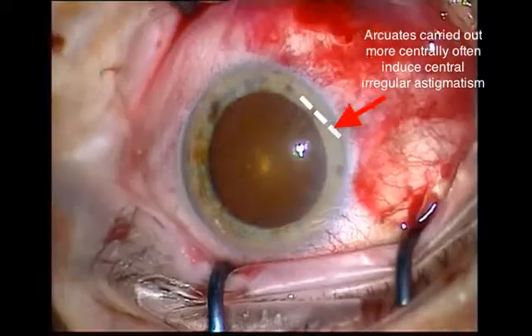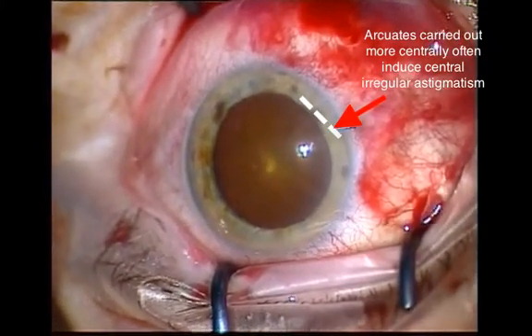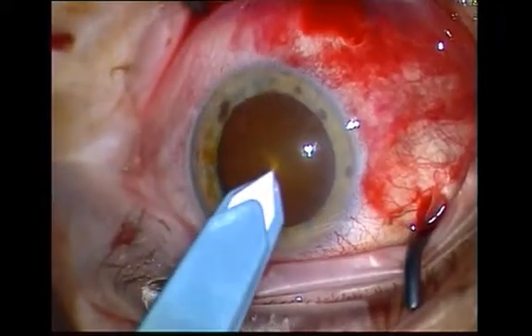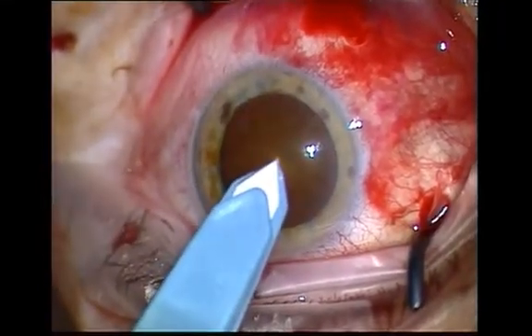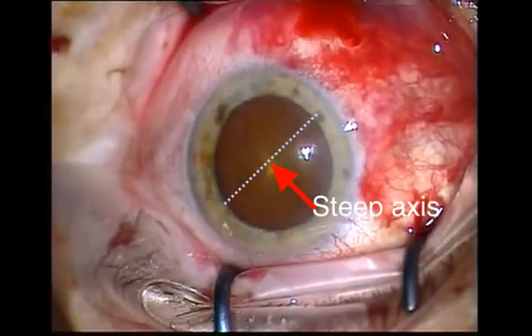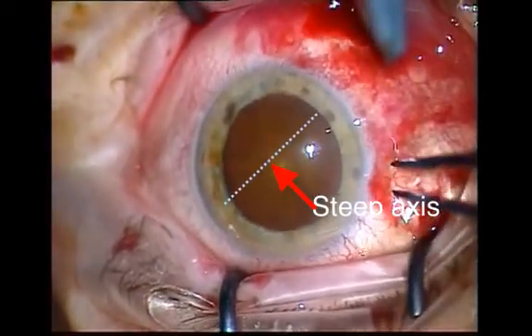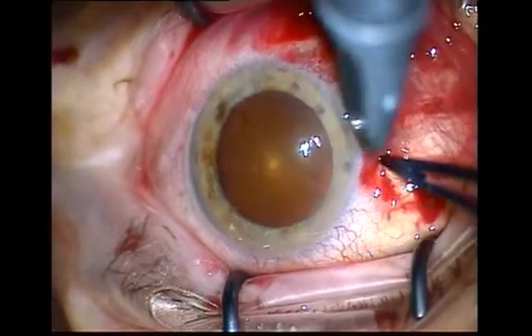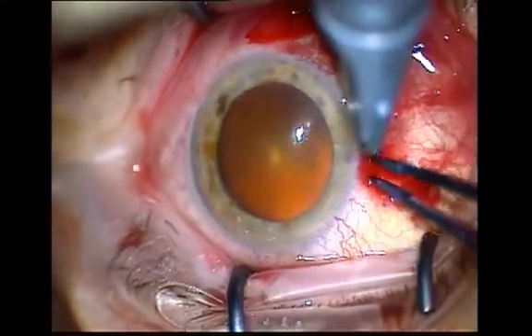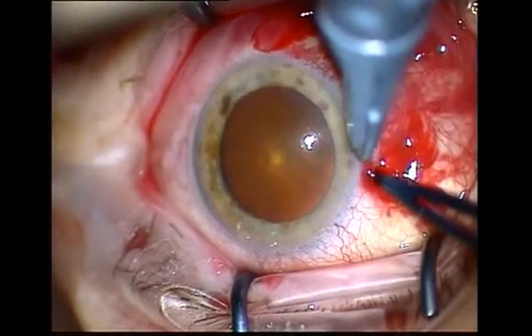Aim to do this close to the limbal region to reduce the chances of inducing irregular astigmatism. At the limbal region, there also tends to be a 1-to-1 coupling ratio, which means that if the steep axis is reduced by one diopter, there is an equal increase of one diopter in the less steep axis, meaning that the spherical equivalent is unaffected.